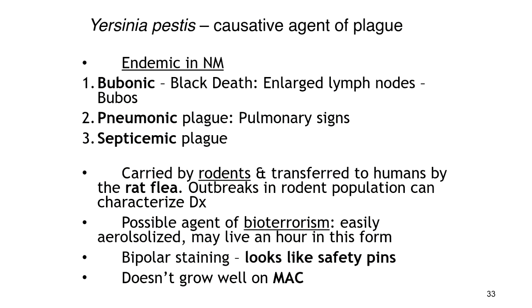interim area in the East Mountain areas especially, and animal hospitals in that area are always on the lookout for this. Yersinia pestis, not only is it zoonotic, but it is a potential bioterrorism organism. You are introduced again, I'm sure, to Yersinia pestis plague in your diseases course. Here in microbiology, we call it a safety pin diagram. It looks like a safety pin. So it is sort of an oblong coccoid or rod shape, but it's pretty dark staining at the outer edges like a safety pin.